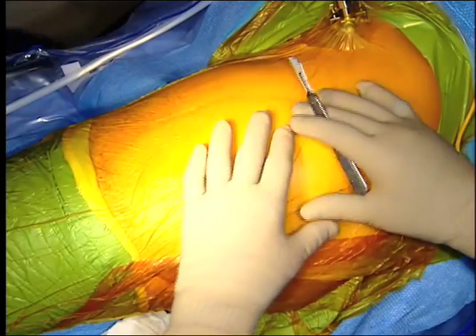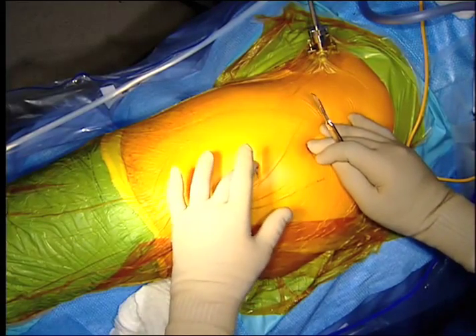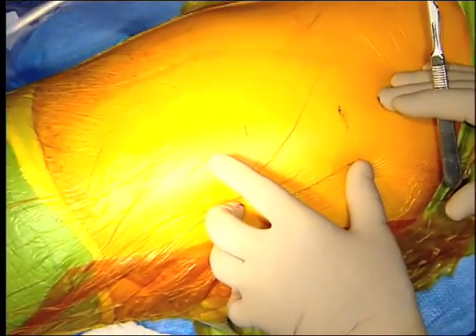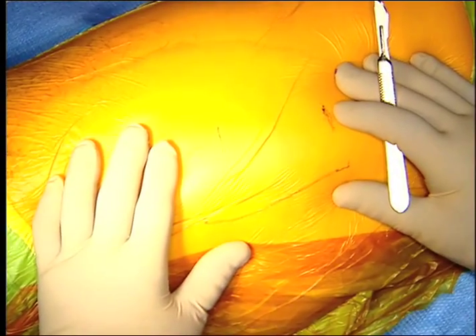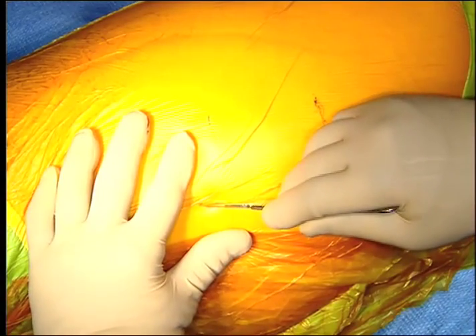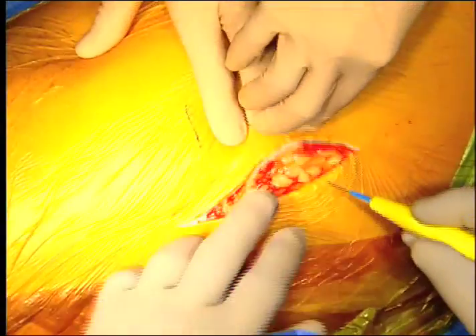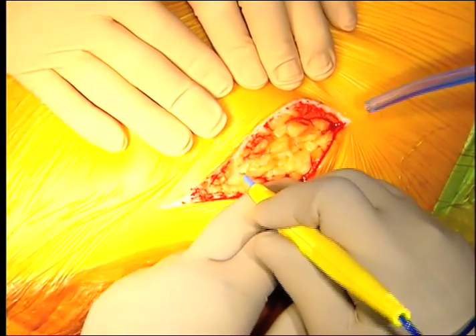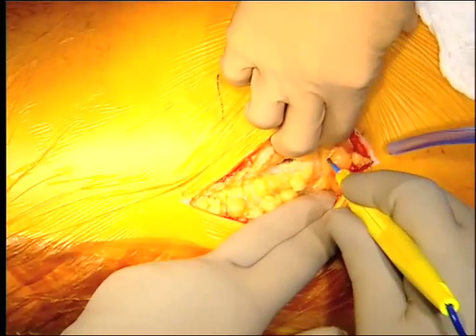The patient is in the lateral position. Here's the tip of the greater trochanter and the vast tubercle. The incision I make is a short posterior incision about the width of my hand — I go five finger-breadths up the back of the trochanter. This incision has given superior results; it's the incision used in reports from Mayo comparing posterior to anterior incisions, and we've published on it.